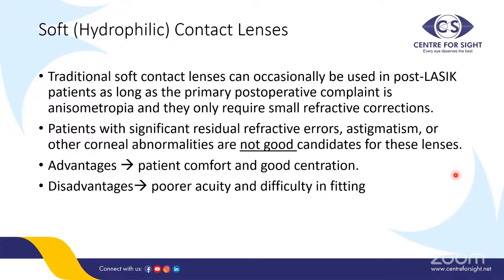Advantages are that if the minor refractive error is treated well with these contact lenses, patients are comfortable, and also these being soft, they offer good centration. Disadvantages are that they don't perform well in large refractive errors, and also they sometimes offer poor visual acuity and difficulty in fitting.